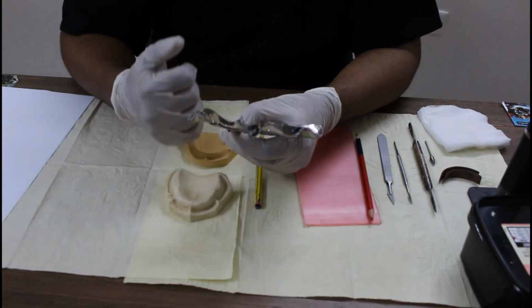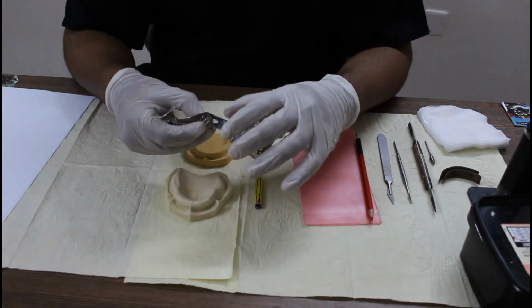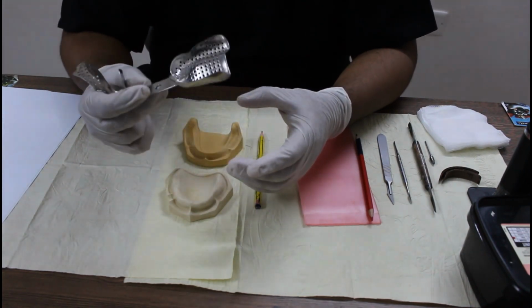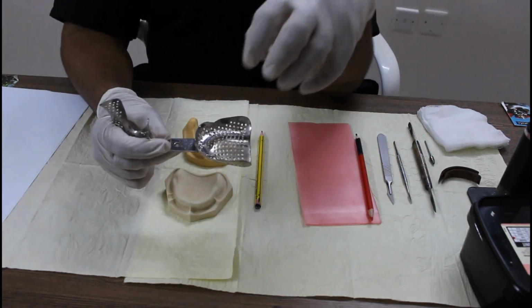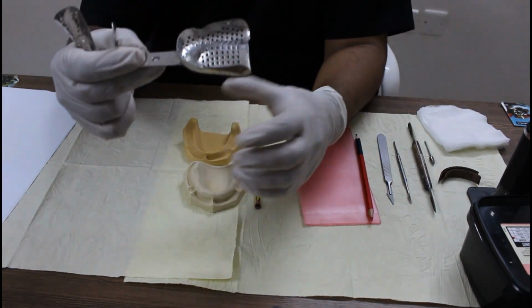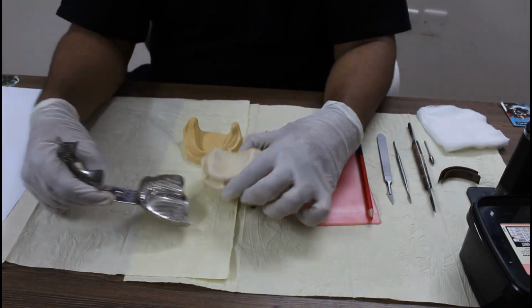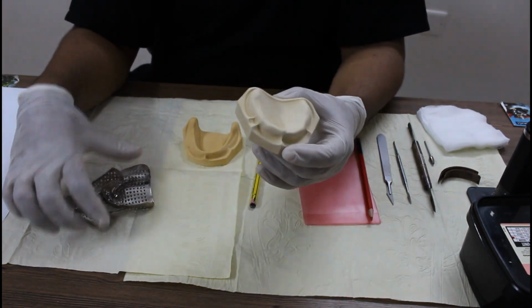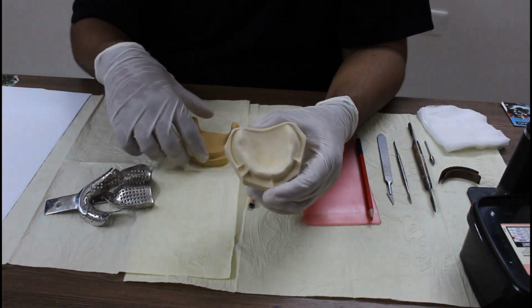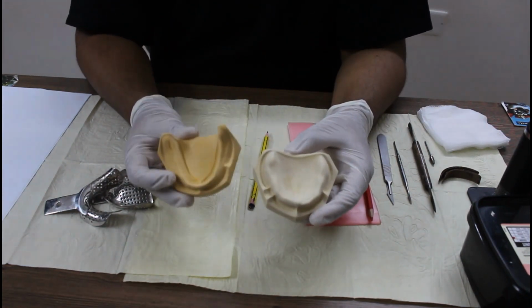When the patient comes to you for the first time, you take these trays and you make one impression using alginate, what you all practiced in week 2. When you make an impression with alginate, you pour dental stone and you get a cast. So now you made an impression of the patient's mouth, you pour the stone and you get a cast. This cast is called a primary cast. So you have a primary cast for the maxilla and a primary cast for the mandible.